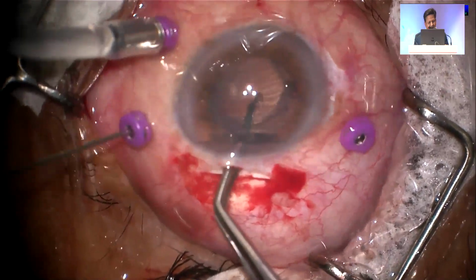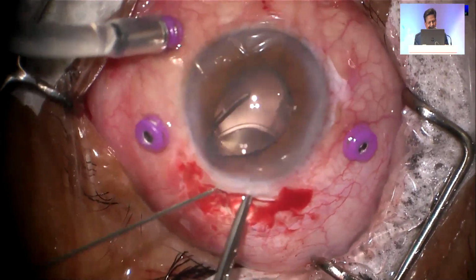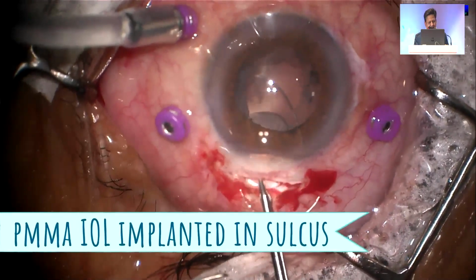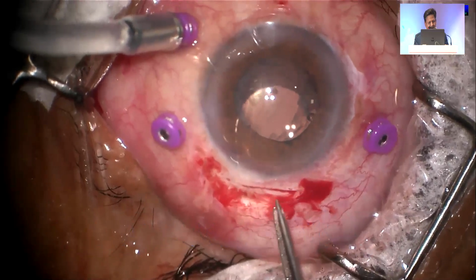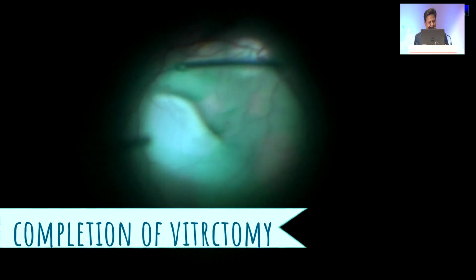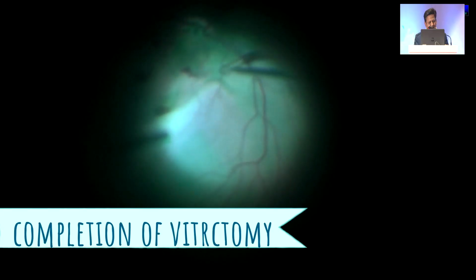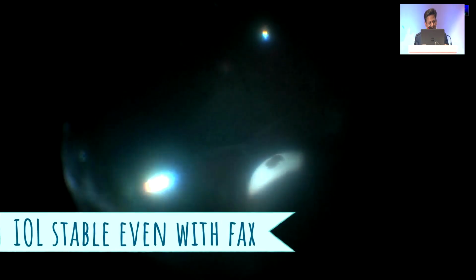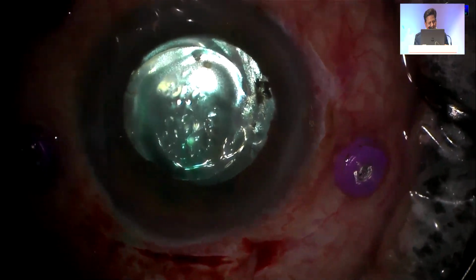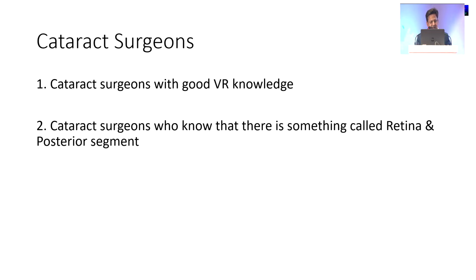So here the lens is being brought up and removed, and another lens is being put in. Because the capsule is adequate, the lens can be put in the sulcus here. The lens is put, and further the retinal detachment is managed. I'm doing a primary ILM peel in this patient also, and now you see fluid air exchange being done. The break was treated, and oil was used as a tamponade.